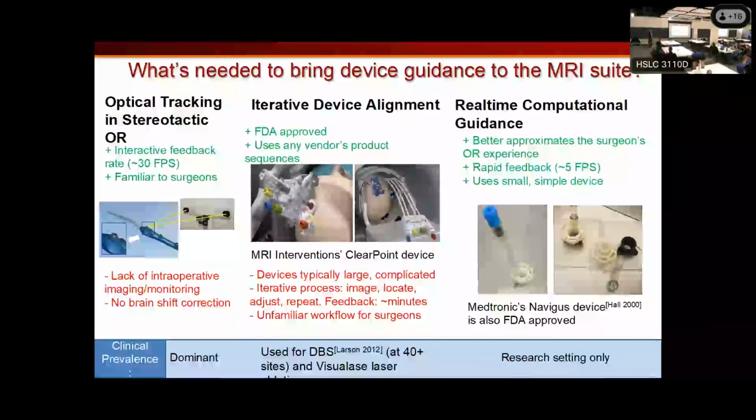Okay, MRI works in a different realm. It doesn't work in a geometric realm like CT or ultrasound. It works in a Fourier domain. So it's solid state, but it essentially can take one measurement at a time. If you think about a CT scanner, 64 slice CT scanner with 1,000 detectors per row, that's 64,000 measurements per time. MRI is taking the order of one, maybe with some sophisticated things with coils, we take 8 measurements at a time. So that's why it's so slow.